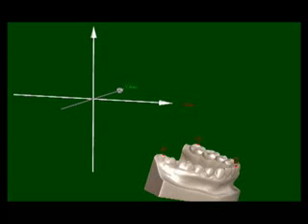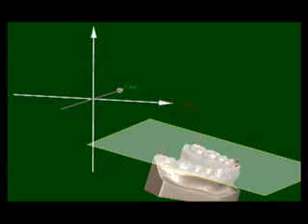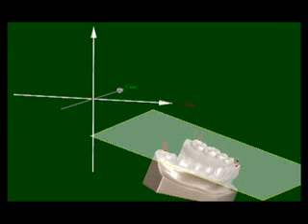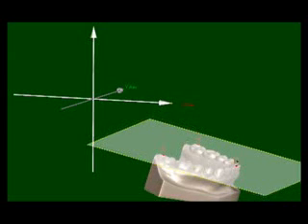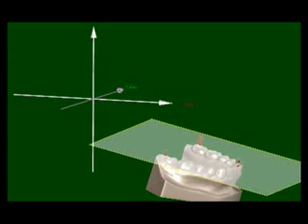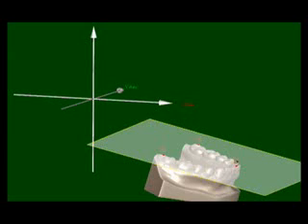First, a lower occlusal plane is defined and set at an angle to the horizontal. A hinge axis is then located at a specific axis incisal distance and vertical height. The articulation is readily changed based on patient-specific data. Here we see the effect of changing the lower occlusal plane angle, the axis incisal distance, and the vertical height.